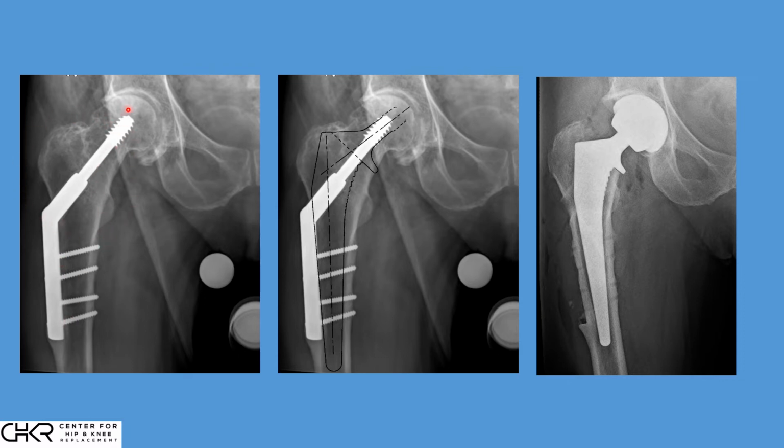Now, again, fortunately, this fracture is healed. Unfortunately, this hip has become arthritic. The prior patient developed necrosis. This is what's called post-traumatic arthritis. But as we proceed with templating, we can see that the plate and the screws clearly block the path of a femoral stem. And so the same three steps, we need to identify the manufacturer. Several manufacturers make different side plates and hip screws. We need the right tools.